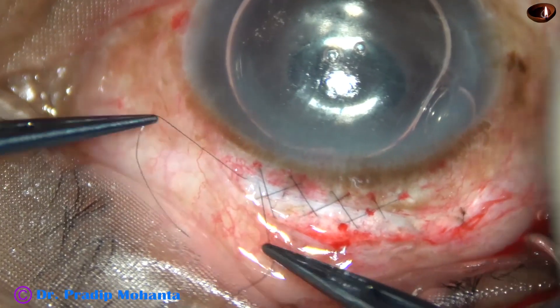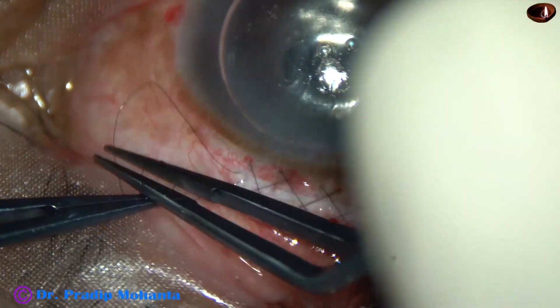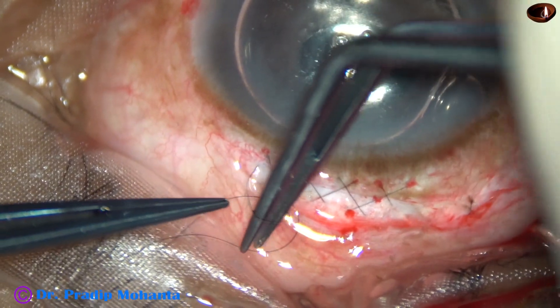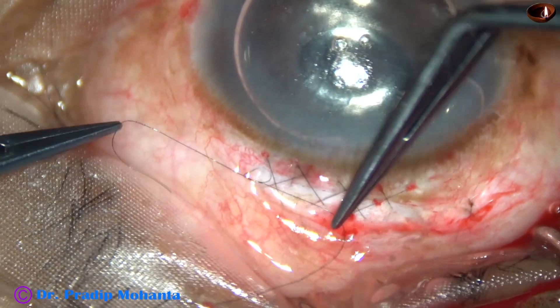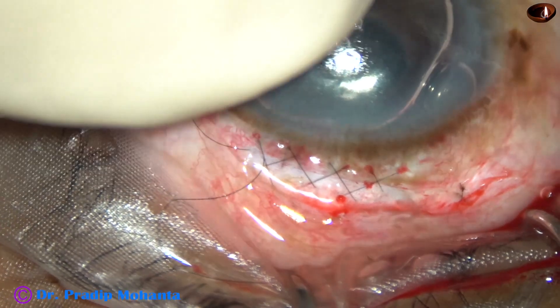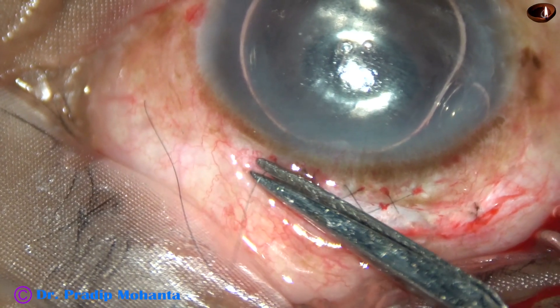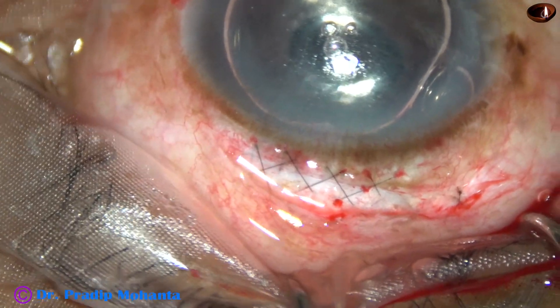And now this is the final knot of the shoelace suture to close the main wound. The threads are trimmed and the knot remains buried in the sclera, in the groove of the wound.